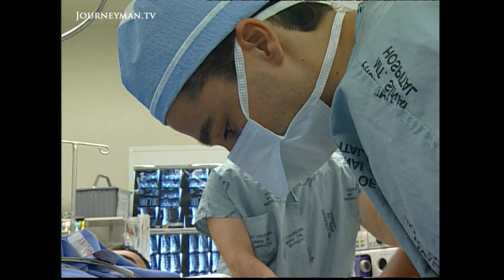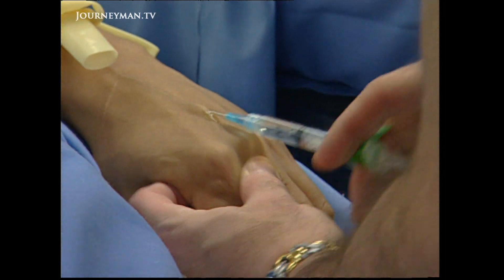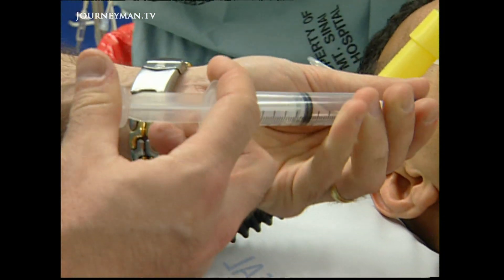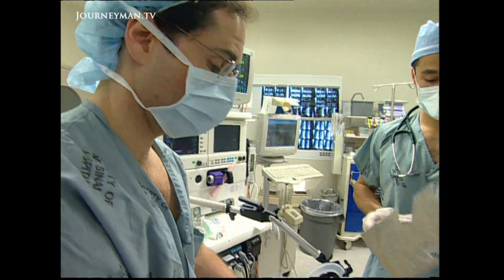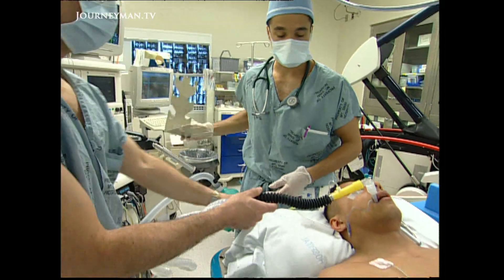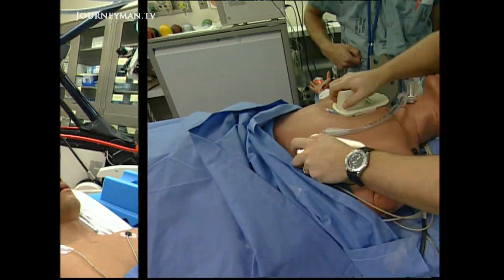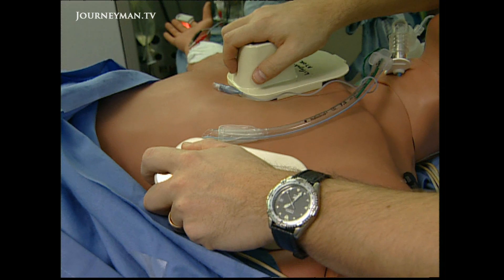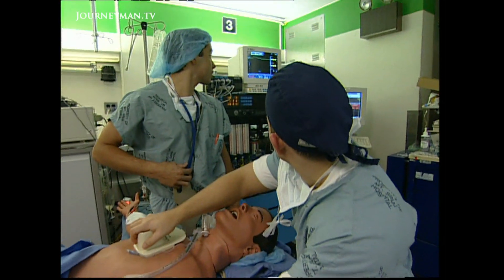In the real operating room, Dr. Baez has better luck finding a vein in the patient's other arm and has no trouble with intubation. The patient is anesthetized and stable. Hal, though, has died.